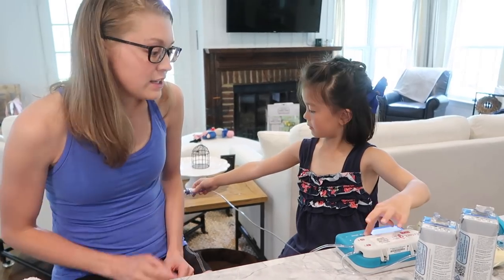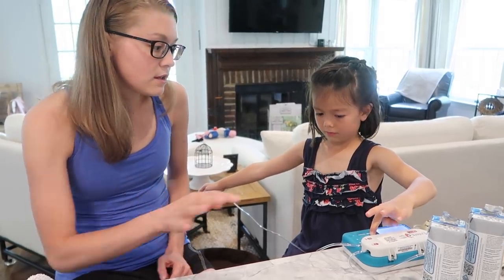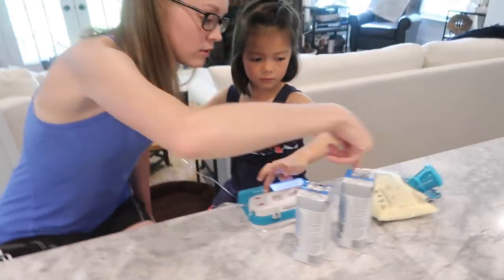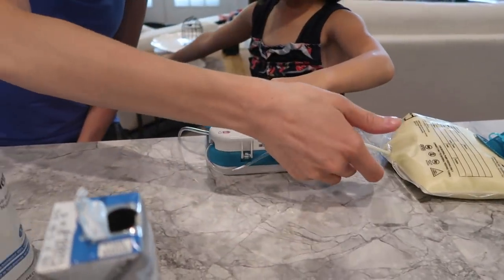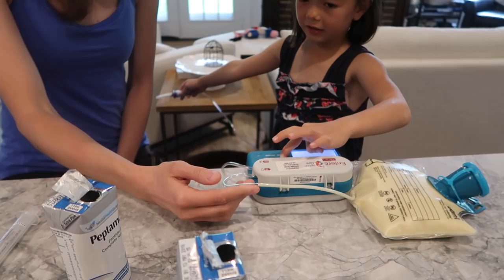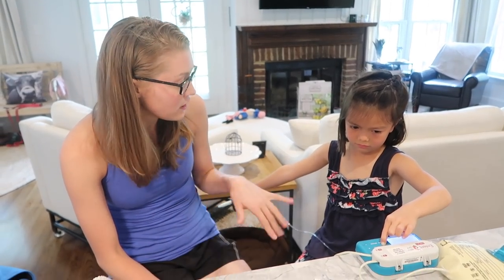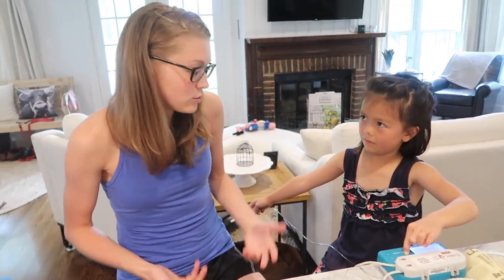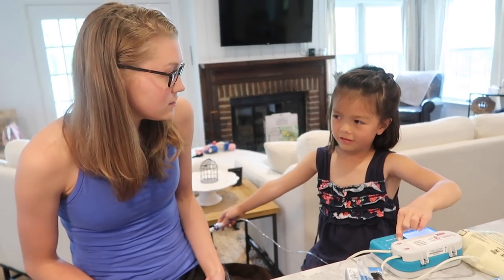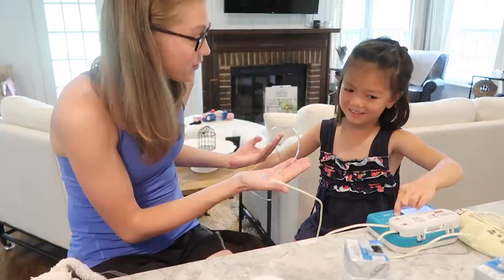It's nice and loud, and you remember to hold the prime down. Just keep holding, and you're going to see it suck up the formula. See, it's pulling the formula into this too. Just let me know when to stop. It's going to take a while. Do you think that this is a doable thing for a five-year-old? I think so.